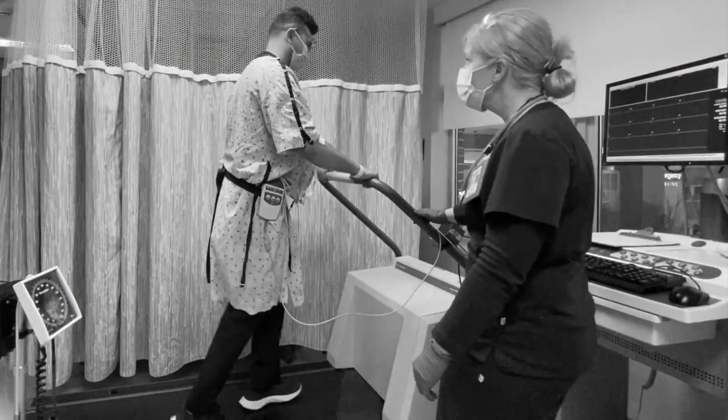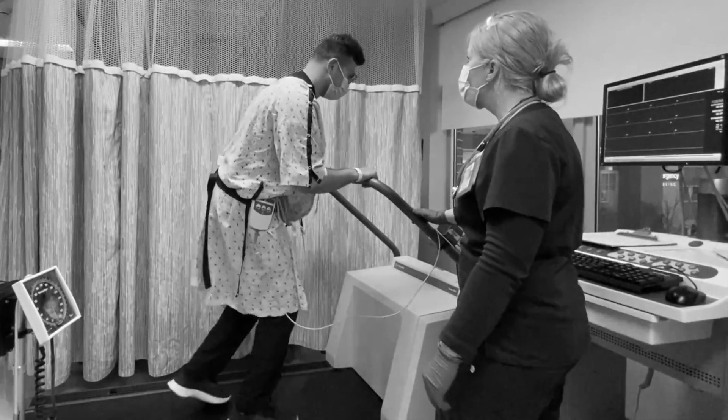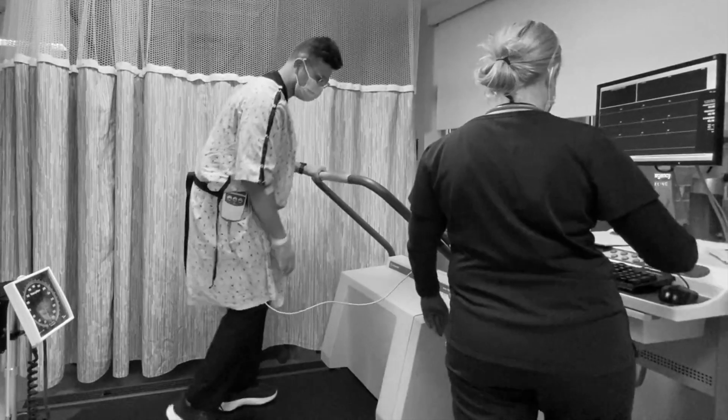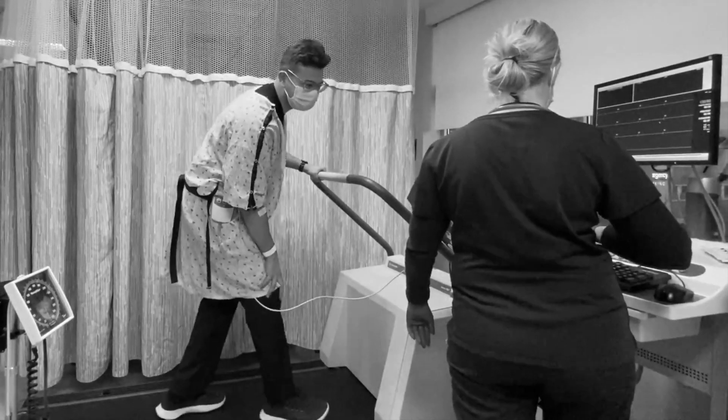If you are having pain in your knees, hips, or back that would prevent you from walking safely on a treadmill, let the nurse know. If you have not used a treadmill before, the nurse will demonstrate how to walk on the treadmill.